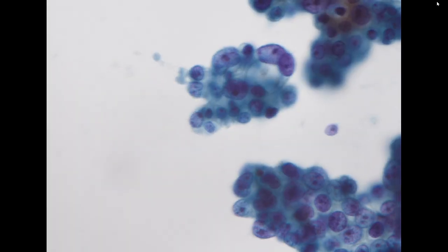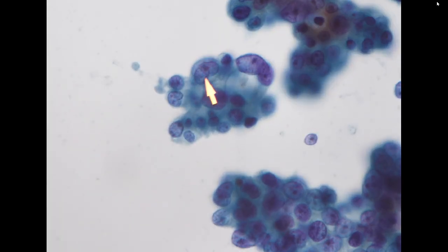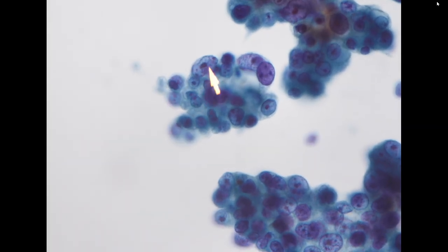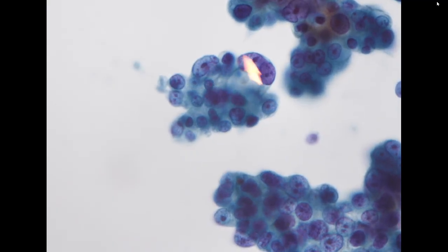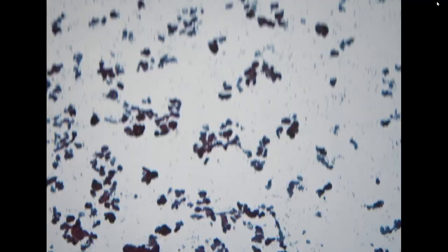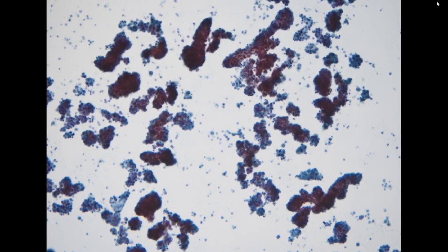We have a lot of three-dimensional glandular clusters, the nuclear atypia is very prominent, with variation in size and very atypical nucleoli, and these are positive for adenocarcinoma. Given the patient's past history, it is compatible with endometrial cancer with metastasis above the diaphragm.